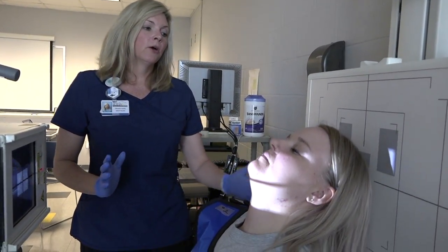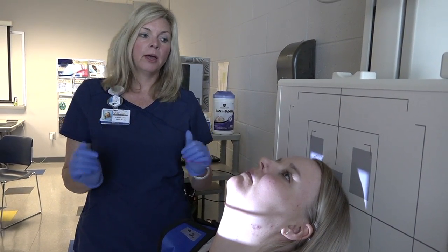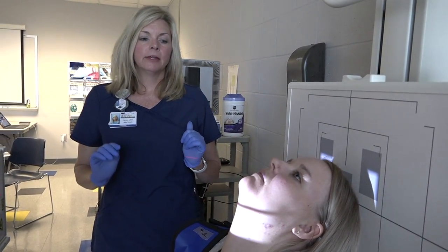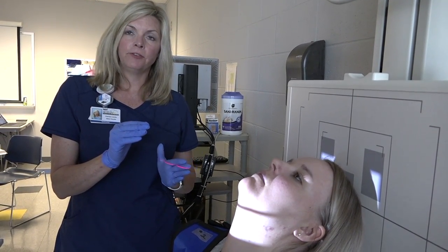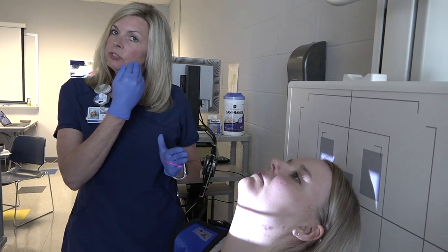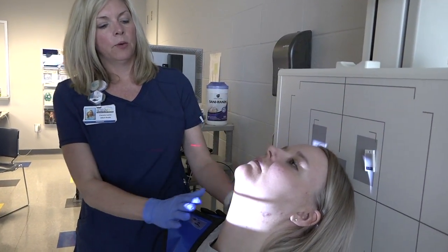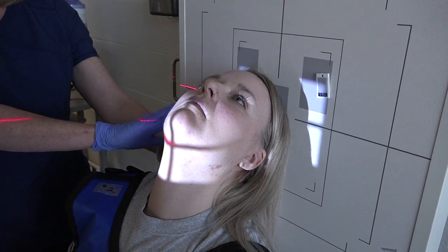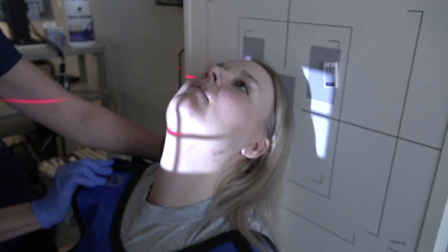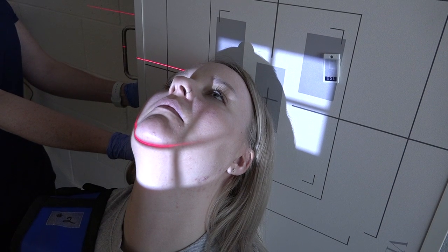Our next projection is the tangential. You start with the patient in an SMV position, then have the patient rotate 15 degrees towards the side of interest and tilt 15 degrees towards the side of interest. This skims the zygomatic arch of interest, which is on the left side. The central ray will skim the ramus to the zygomatic arch of interest.